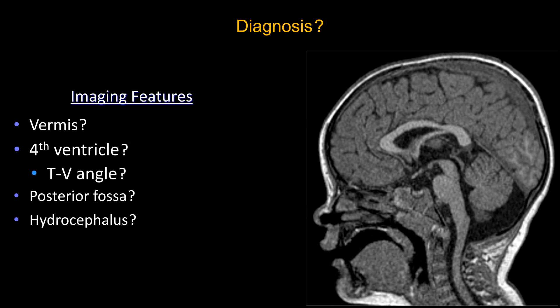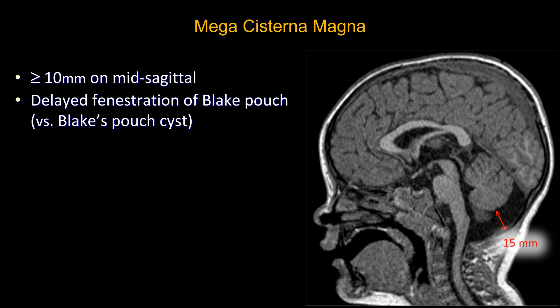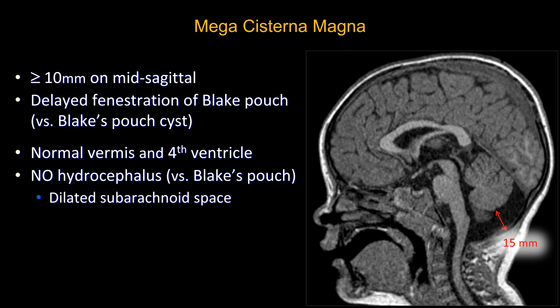What about this case? The vermis looks normal, the fourth ventricle is also normal, the TV angle is zero, the posterior fossa is not enlarged, and there is no hydrocephalus. This is mega cisterna magna. If the inferior aspect of the subarachnoid space is greater than 10 millimeters on the mid-sagittal view, you have mega cisterna magna. It is due to delayed fenestration of Blake's pouch — unlike Blake's pouch cyst where the pouch is not fenestrated, here delayed fenestration leads to enlargement of the subarachnoid space.